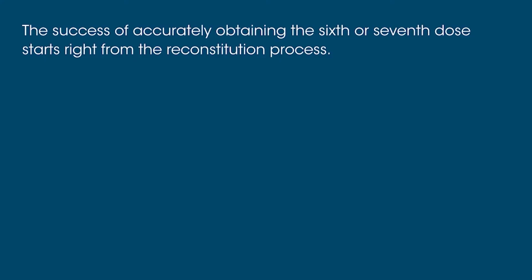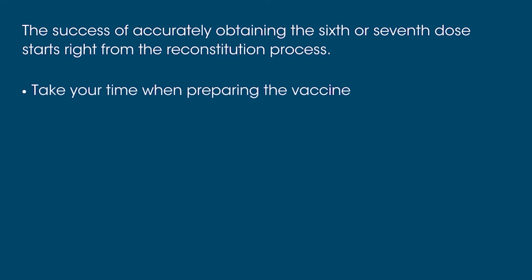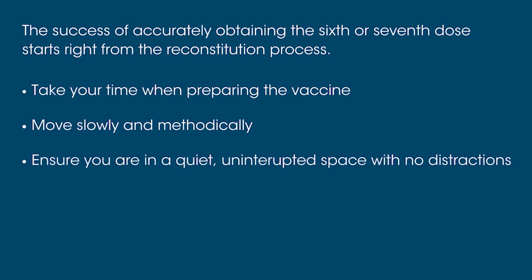The success of accurately obtaining the 6th or 7th dose starts right from the reconstitution process. Please take your time when preparing the vaccine. You must move very slowly and methodically. We recommend that the professional preparing the vaccine is in a quiet and uninterrupted setting with no distractions.